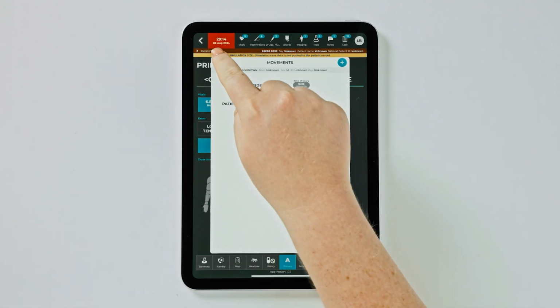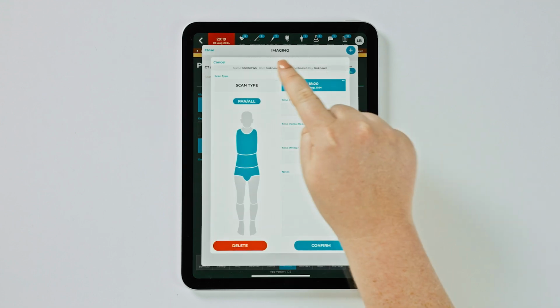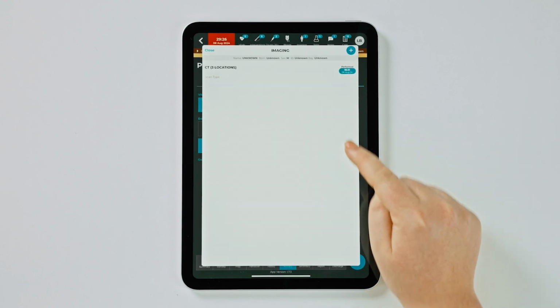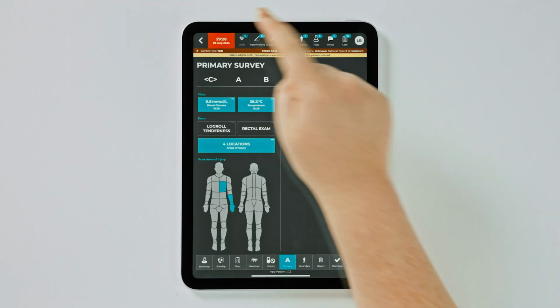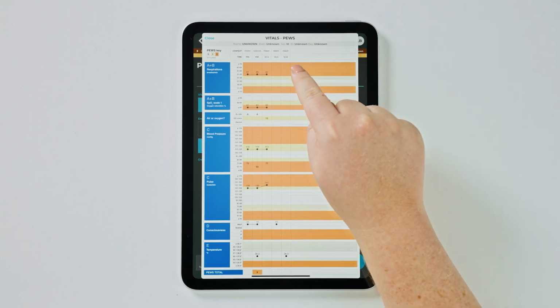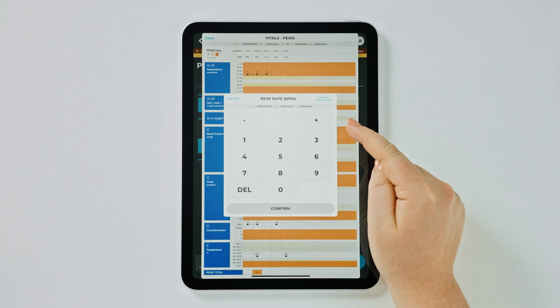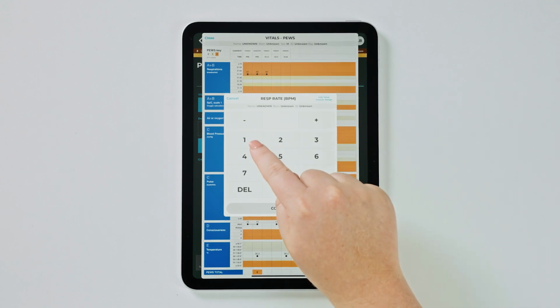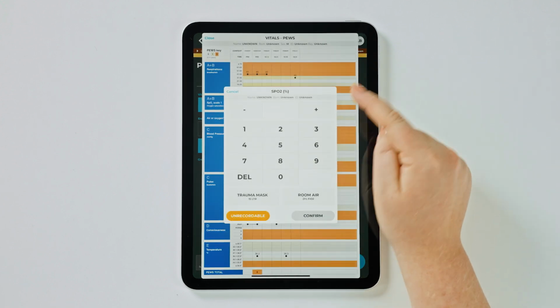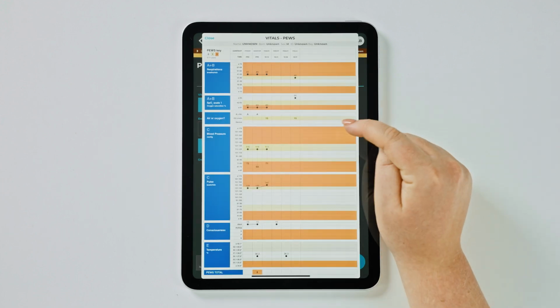Now that the patient is in CT, the imaging request can be updated. The time the scan was performed is entered, and whilst the scan is being undertaken, the scribe can also input a new set of observations. To do this, they would click on the section of the vitals and start entering the time and the result. In this case, Adam's respiratory rate is at 40 breaths per minute. His oxygen saturations are now 95% in oxygen following the needle decompression.